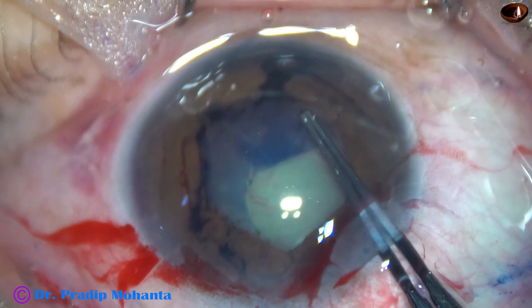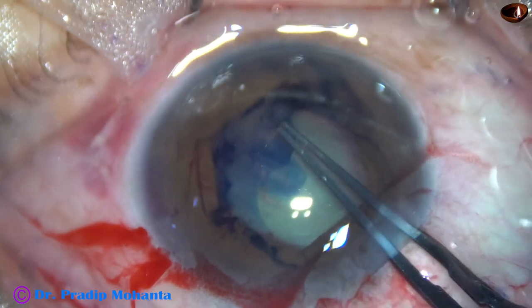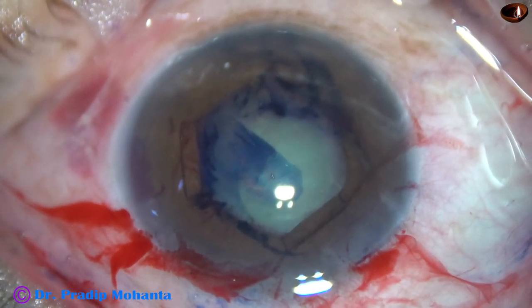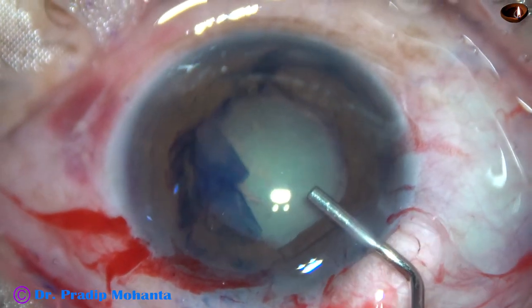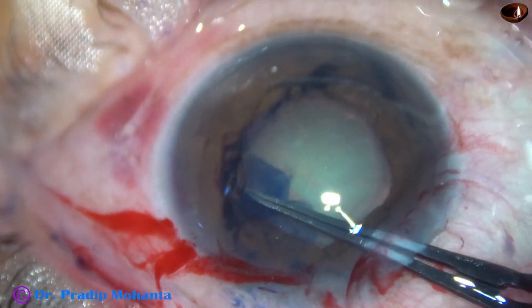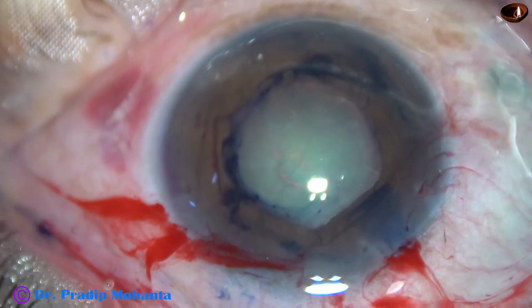The rest of the rhexis is being done with the utrata forceps. When there is positive vitreous pressure, the anterior chamber becomes shallow frequently, so I have to come out in between, inject visco again to make the anterior chamber deep, and then again use the utrata forceps. And this is a nice rhexis of about 5 mm. Dilatation of the pupil is about 5.5 mm.